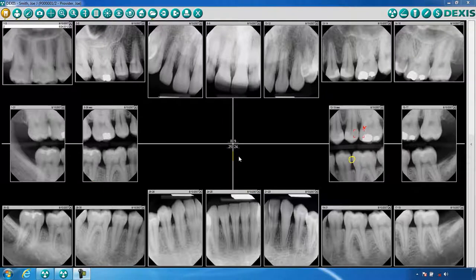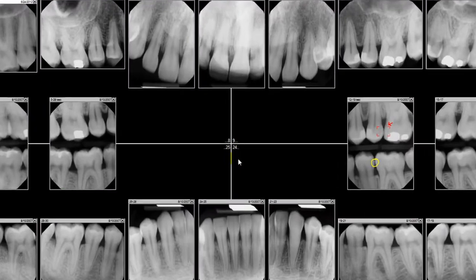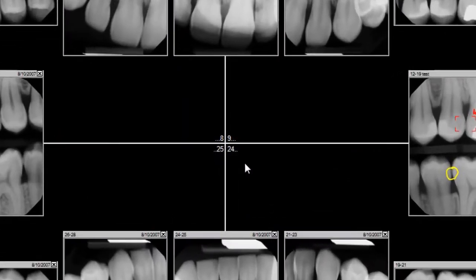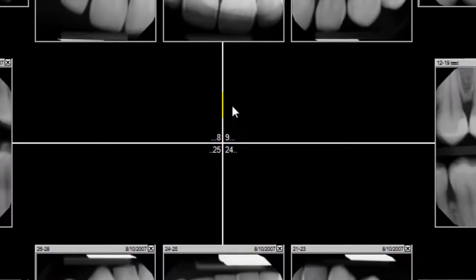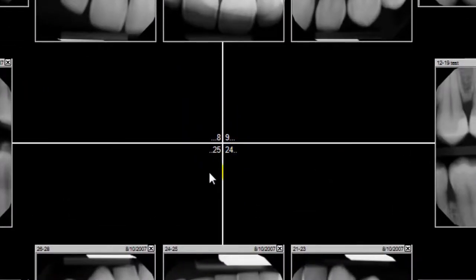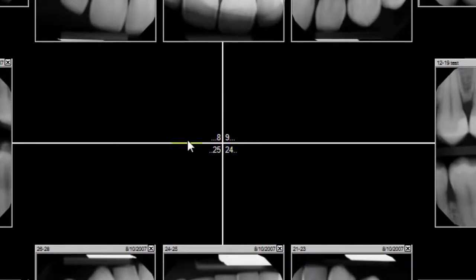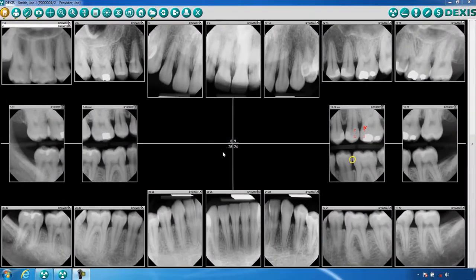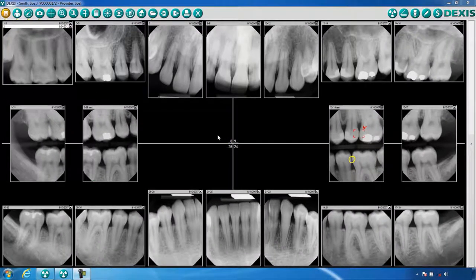When viewing the DEX-Ray or DEX-Image intraoral screen, you will know the orientation or view of your patient's images by the tooth numbers located in the center of the screen. This example indicates that teeth 1 through 8 are located in the upper left quadrant of the screen.